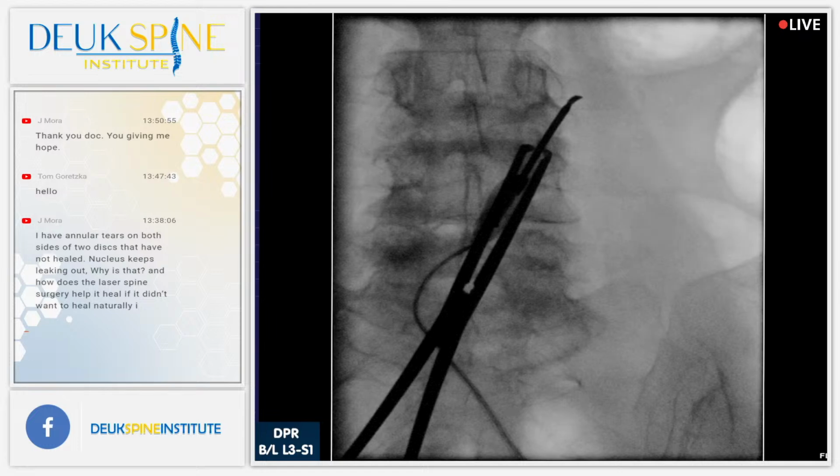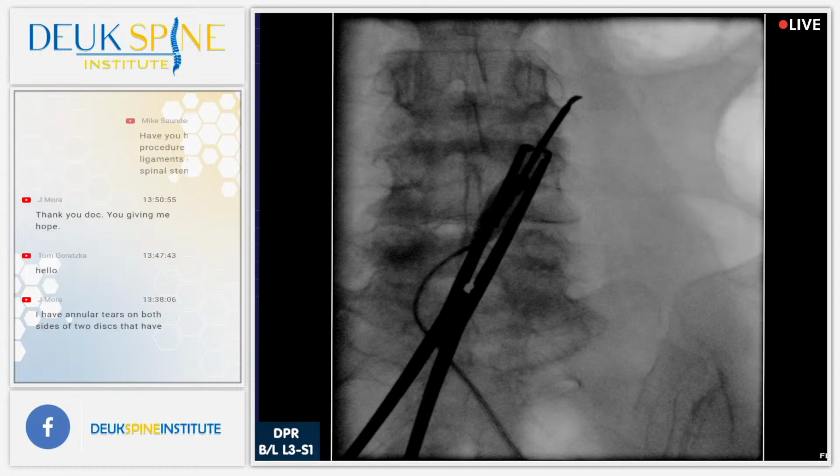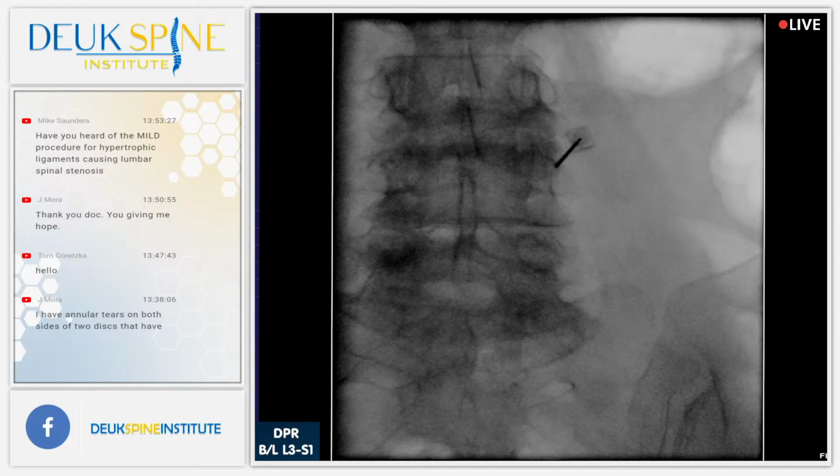We're going to move down to the next location for the medial branch of the dorsal ramus. That's what we're targeting. By the way, I've looked at the new model. That's perfect. Right there.